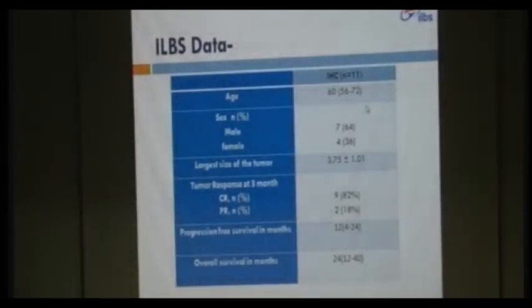11 patients underwent ablation in the last 3 years in our department. Out of these 11 patients, 6 patients underwent RFA and 5 patients underwent microwave ablation. Average size was 3.75 centimeters. Complete response was seen in 82% of patients and partial response in 18% of patients. Progression-free survival was 12 months and overall survival was 24 months for the 3-year data analysis.